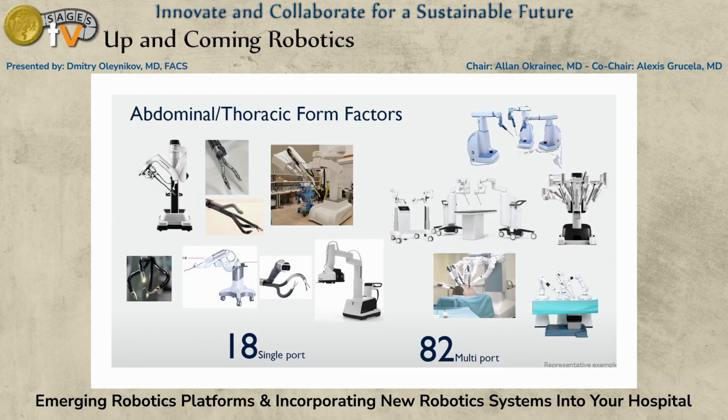There are different form factors. You can see that there are robots that have multiple arms, multiple pedestals, robots that are on the floor, robots that are attached to the bed. There are 18 single-port robots in development. There are 82 multi-port robots in development or developed for different applications, including some of the pictures that I showed you earlier. So it's really an incredible explosion of technology that we're seeing. And the value in the end has to be that the patient gets a great outcome through a smaller incision. And then the value to the surgeon is that they have to be able to do it in a way that they feel is reproducible, is safe, and that supports their practice.